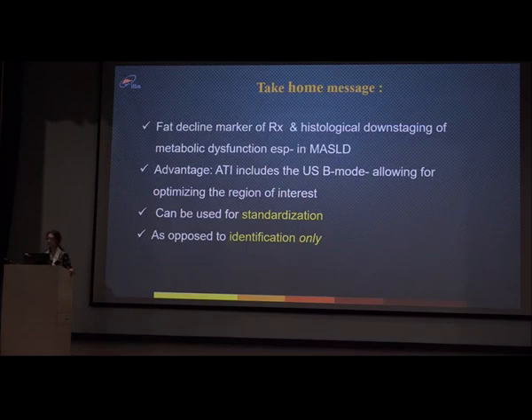So what are the take-home messages? Fat decline is a marker of treatment and histological downstaging. It's very important for us to look at it in the MASH group. The advantages are that ATI is integrated with the ultrasound. You can see what you're doing. It is a more objective criterion, definitely more than anything else we're using right now. And it can be used for standardization, whereas AI algorithms can be added on this to actually predict scores and various different etiologies and not just identify fat. So that's it.